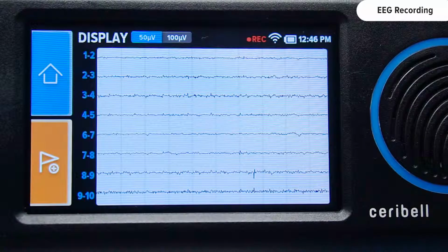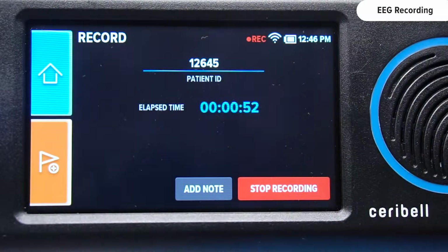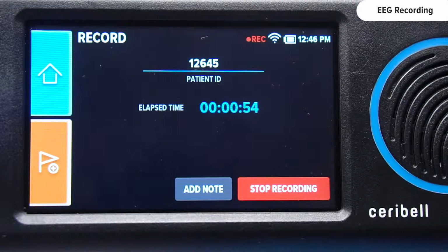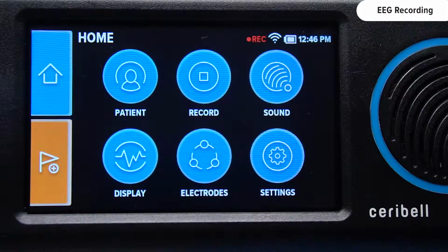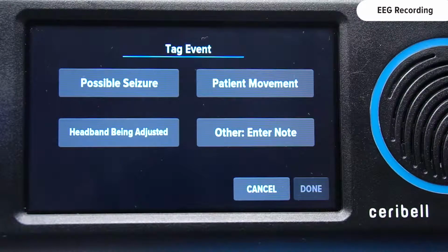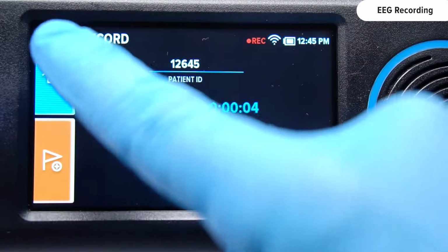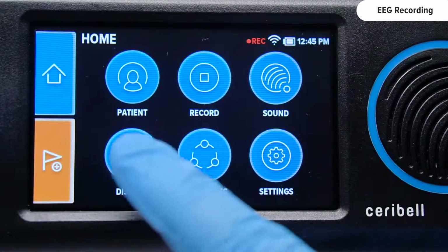You can check the recording status at any time by touching Home and then Record. If at any point during the recording you identify a portion of the EEG that should be noted, touch the flag button on the lower left side of the screen. Flags can be labeled as possible seizure, patient movement, headband adjustment, or a customized note. To view the EEG waveforms, go to the Home page and touch the Display button.